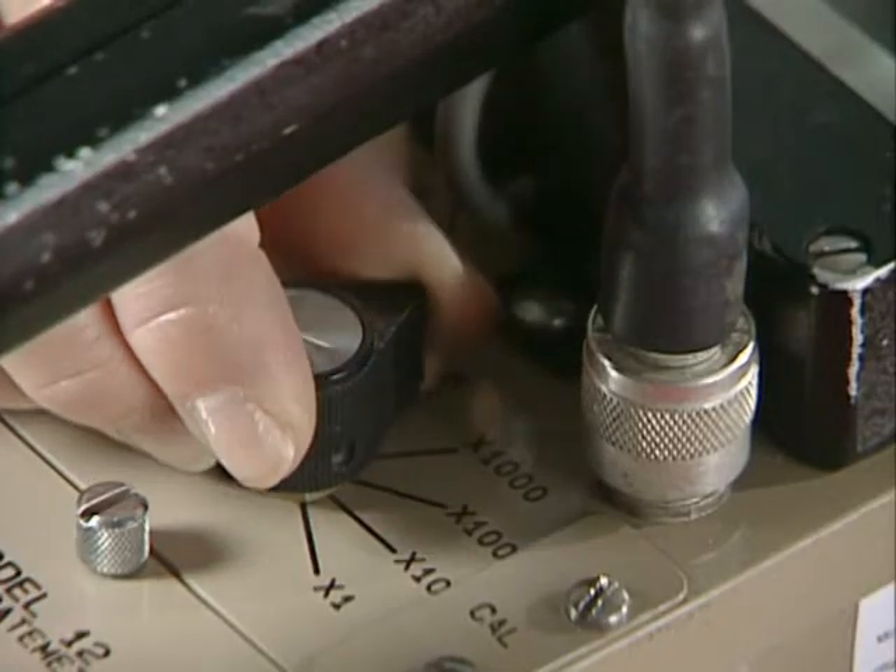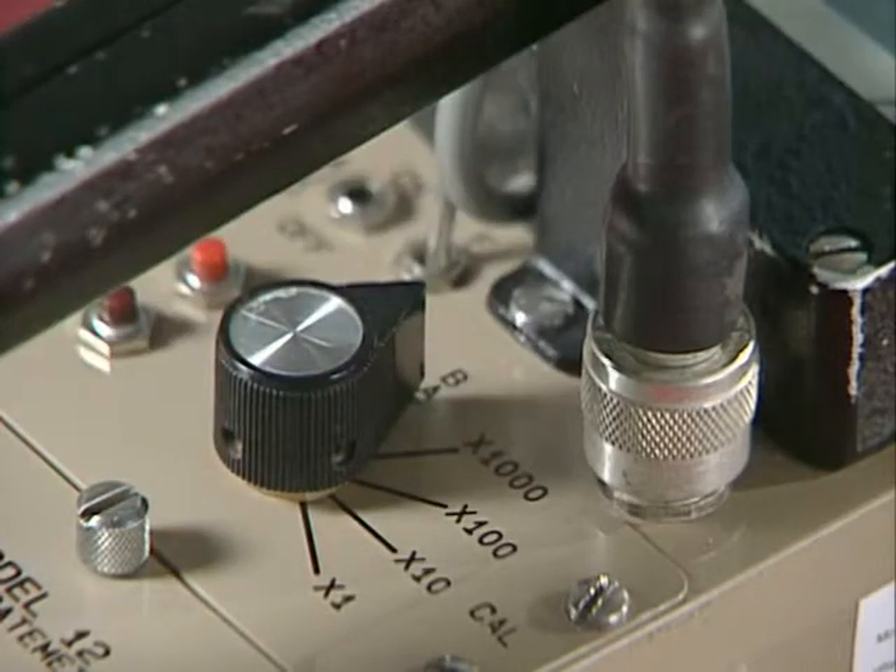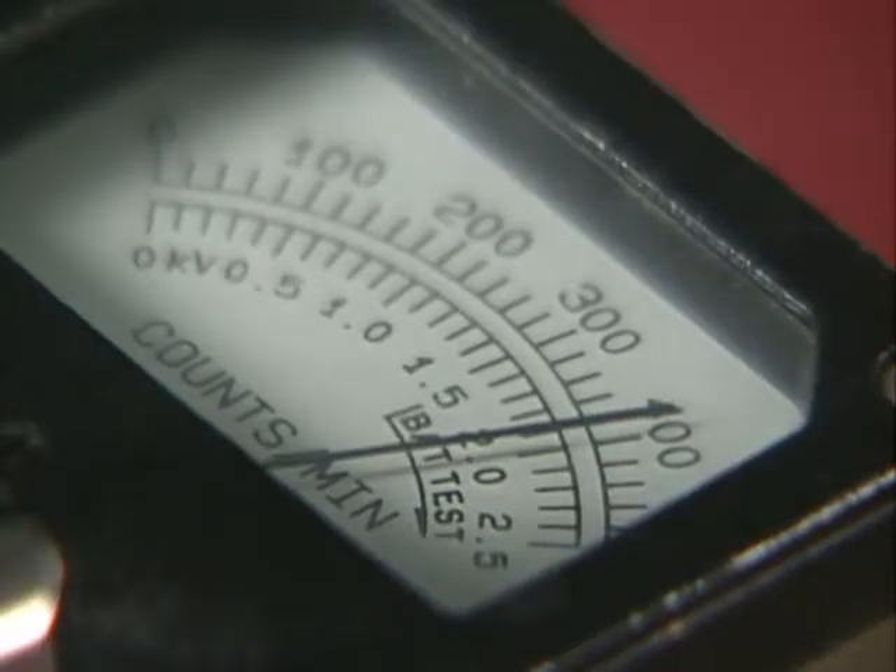Next, check the batteries. Your meter will either have a range switch that you turn or a button that you push to check the battery condition. If the needle on the meter does not move to the position that indicates the batteries are okay, go ahead and replace them, and then repeat the battery check.